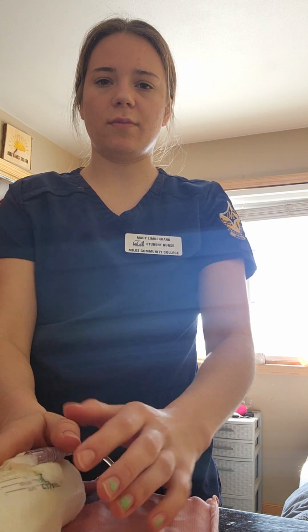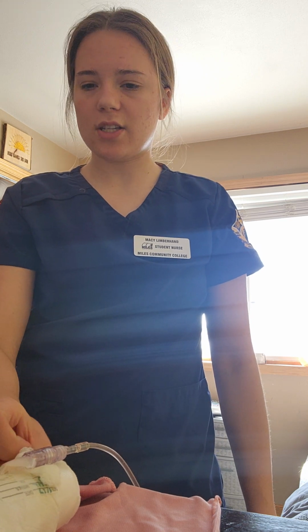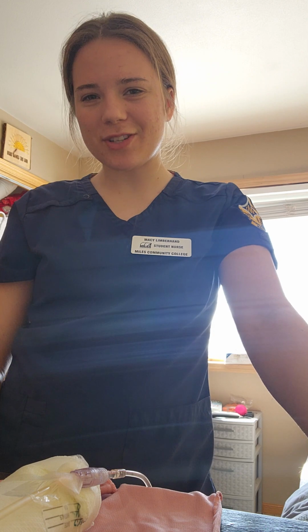And it actually looks good. I'm gonna check for warmth, bleeding, stuff like that. And my patient seems to have tolerated it well, so I will wait and just see her when the provider orders something next. Thank you.